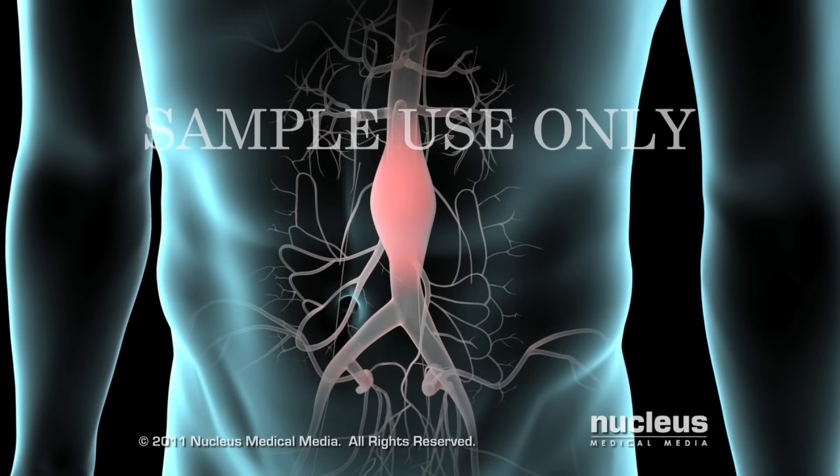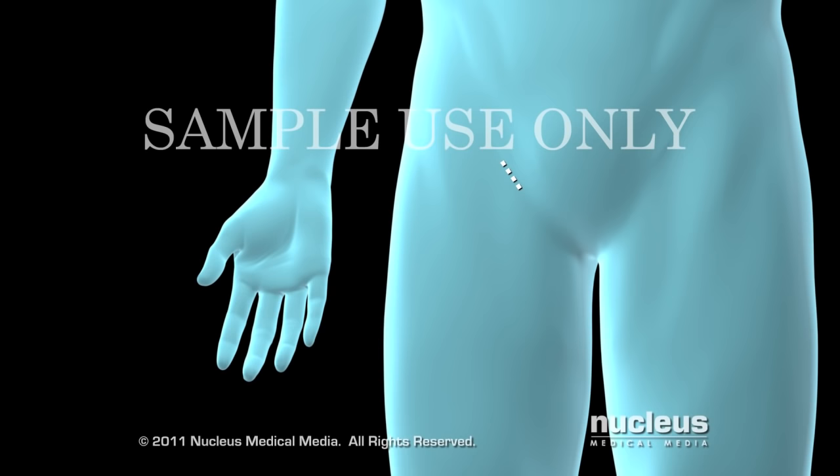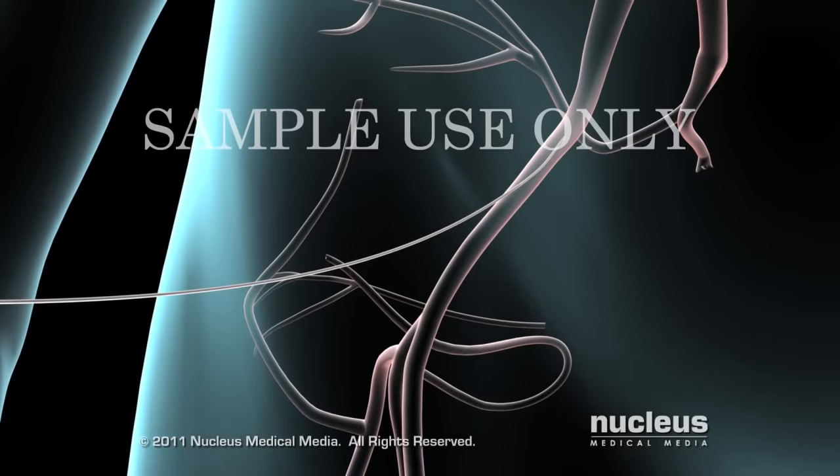Your surgeon will begin by making a small incision in your groin over your femoral artery. Then he or she will insert a guide wire into the artery and gently push it up toward the site of your aneurysm.